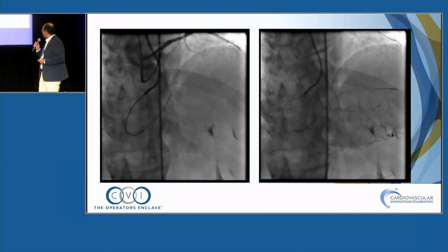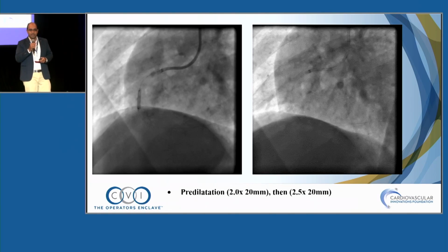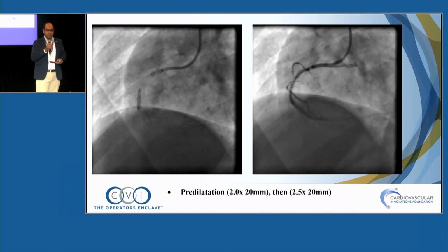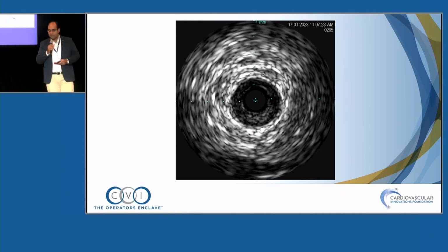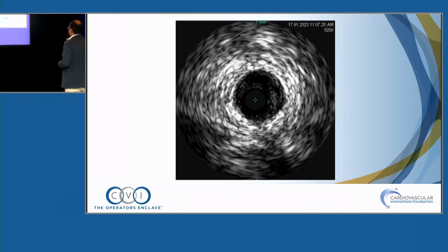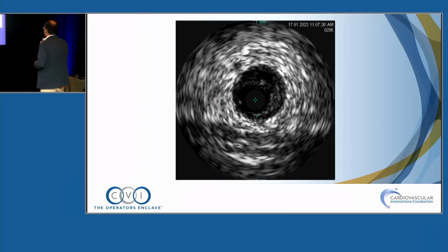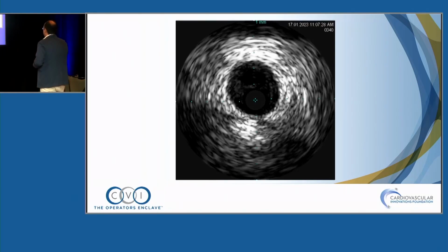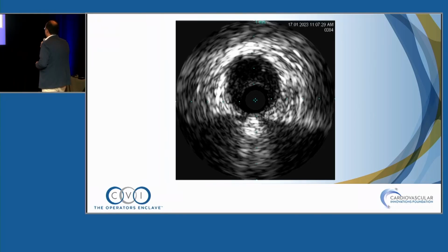Here I replaced it with a workhorse wire, and after dilatation, TIMI 3 flow was established. I put an IVUS catheter in to look at the segment, and you can see here a lovely demonstration of the multiple branches within the woven segment. A lumen appears here at 12 o'clock, another one at 11. Then they unite together into bigger branches. Then this is the proximal RCA.